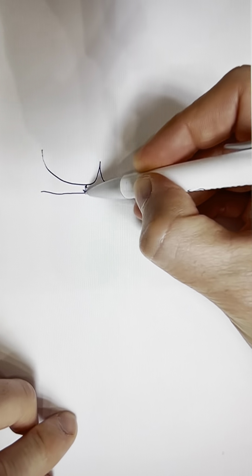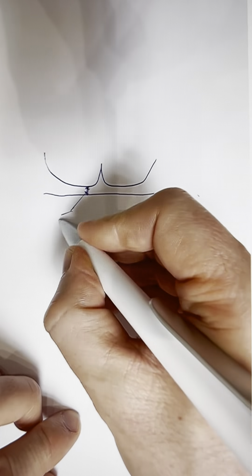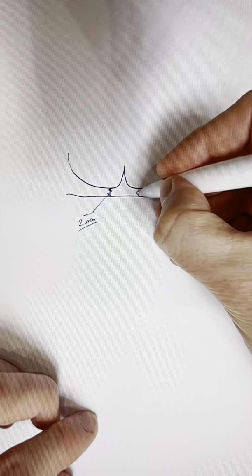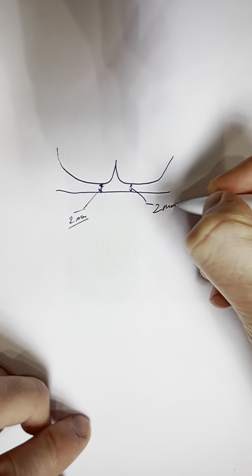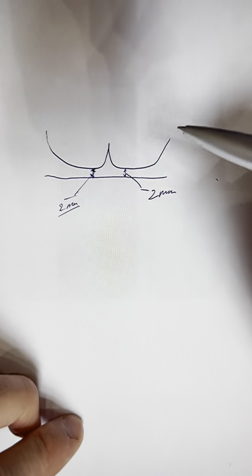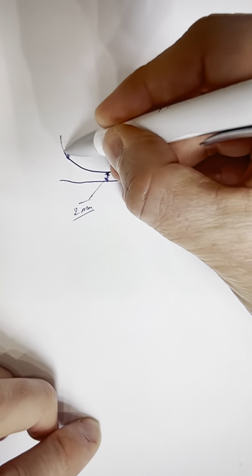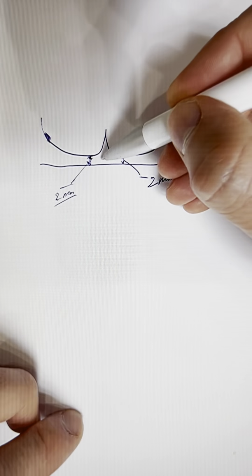Let me remind you that we have 2 millimeters, which is not so much, and here respectively is also 2 millimeters. And here is also a root filling material. You should have seen it on an X-ray. Our goal here is to install an implant in this position.